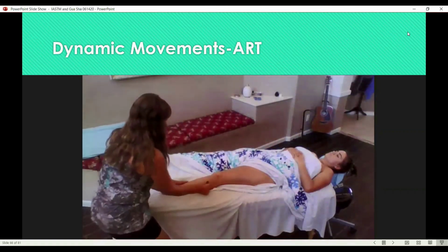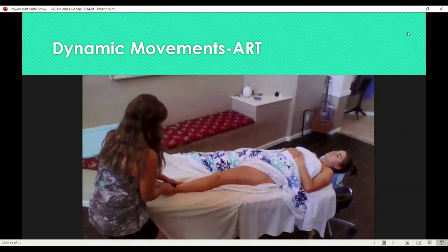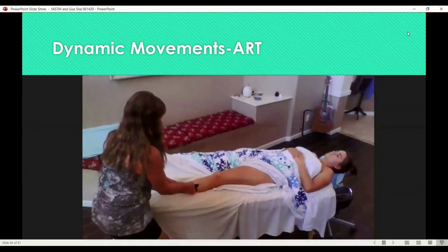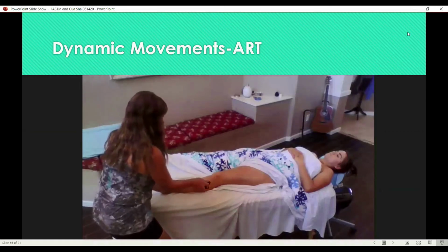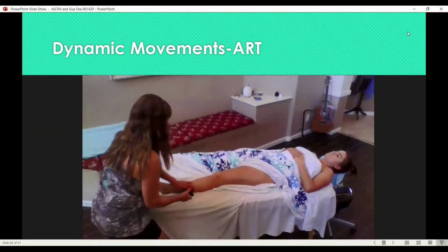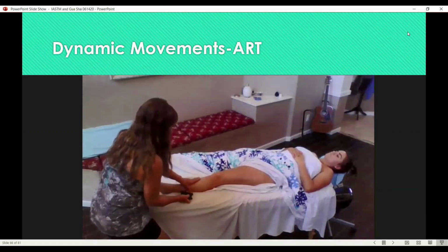Here we can see working on the tibialis anterior, assessing. And I can turn my tool over and do a little J stroking, digging away the tibialis anterior away from the bone. And the other edge kind of follows along, getting into the peroneal muscles on the side.